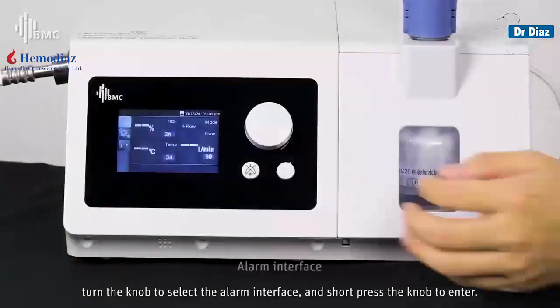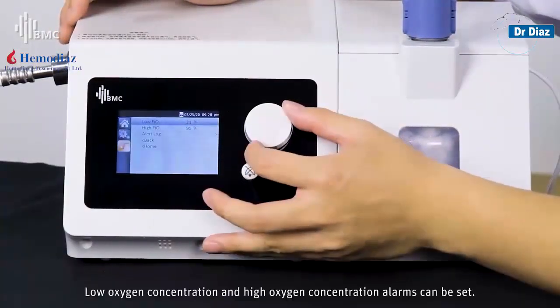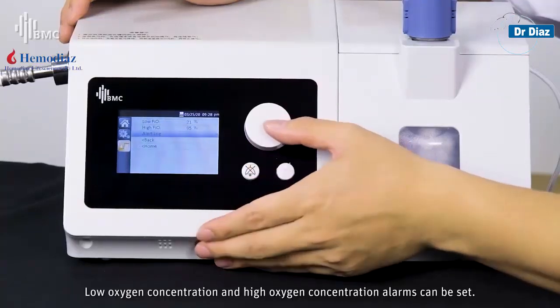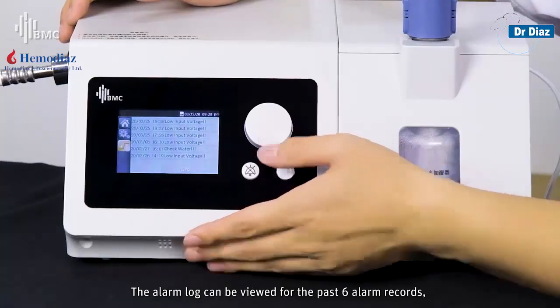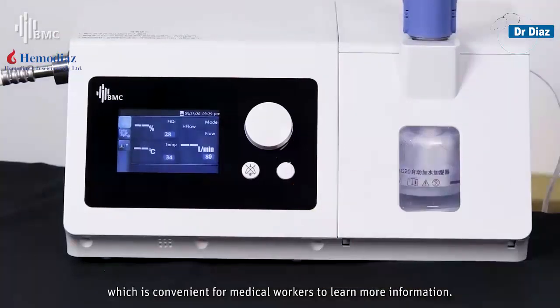Turn the knob to select the alarm interface and short-press the knob to enter. Low oxygen concentration and high oxygen concentration alarms can be set. The alarm log can display the past 6 alarm records, which is convenient for medical workers to access more information.